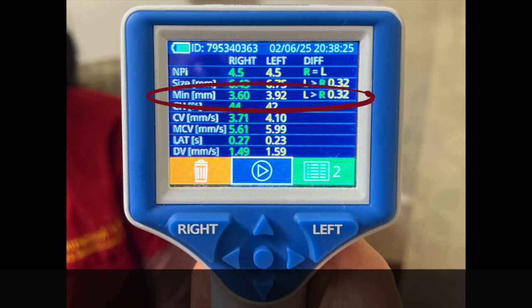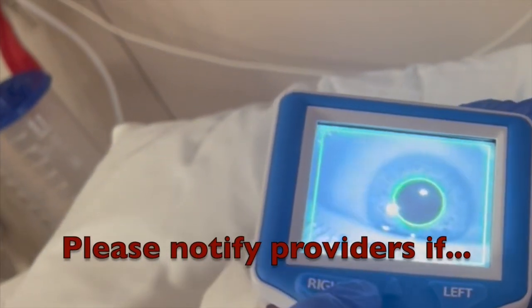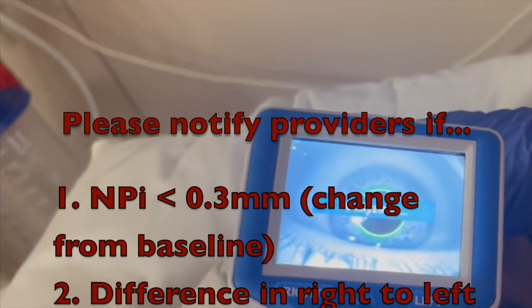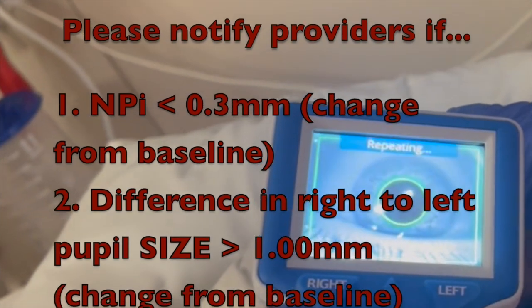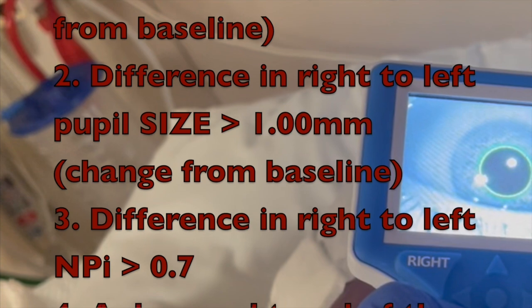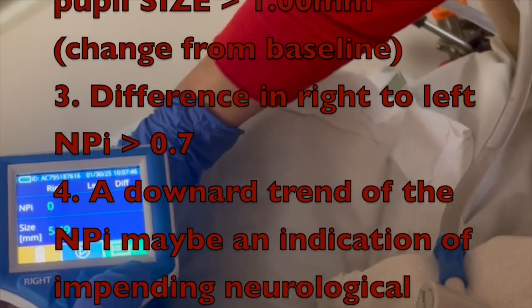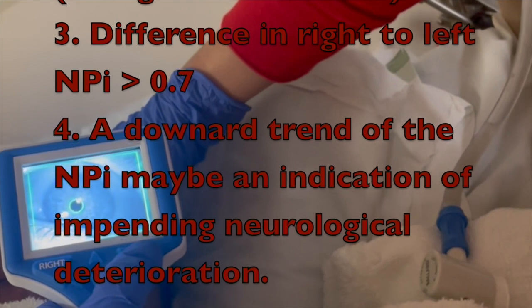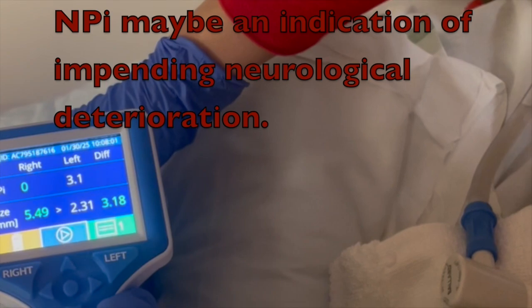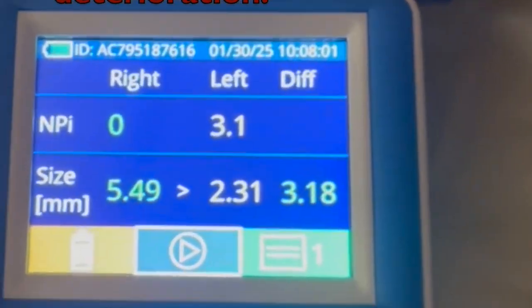The provider should be notified at the discretion of the RN or other clinician with the following significant findings or changes in assessment: an NPI less than 3 if this is a change from baseline; a difference in right to left pupil size of greater than one millimeter if this is a change from baseline; a difference in right to left NPI of greater than 0.7. It is important to note that a downward trend of the NPI may be an indication of impending neurologic deterioration.